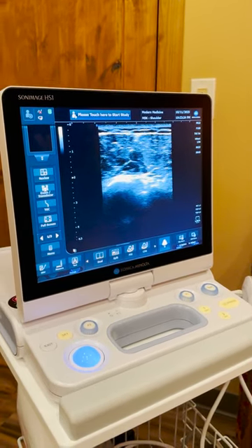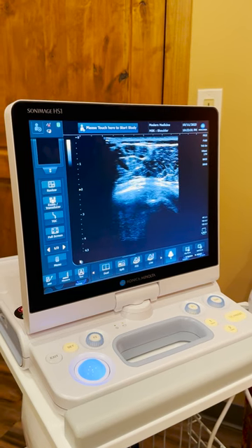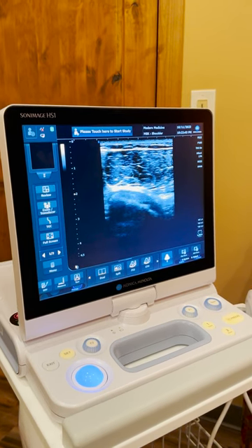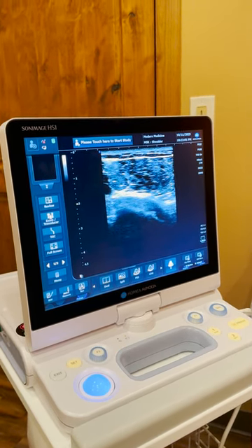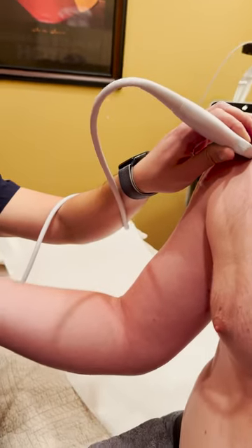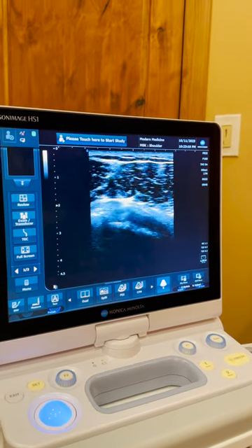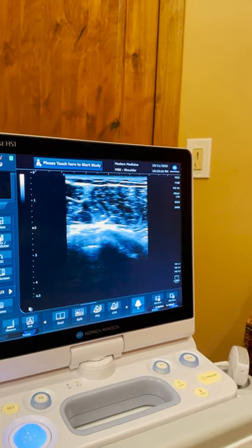As we go up, that structure right in the middle is the biceps tendon, sitting in between those two wedges — that's your bicipital groove. As we go out, we can see the subscapularis tendon, which is part of the rotator cuff. This is important when it comes to internal rotation — very commonly injured, though not as common as the supraspinatus. We can see the bone, which should be a smooth flat surface. Any changes on the bone surface are already an early sign of arthritis or inflammation. This tendon looks pretty good on that subscapularis.